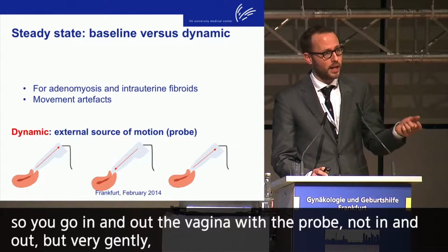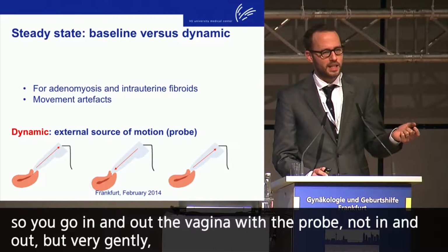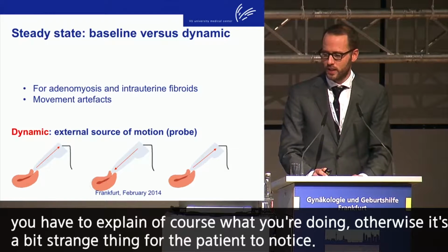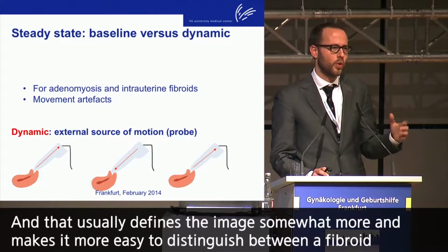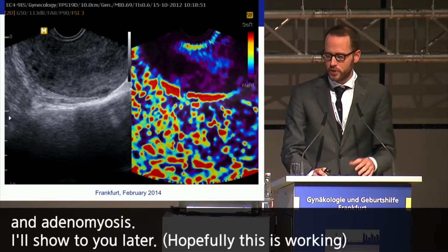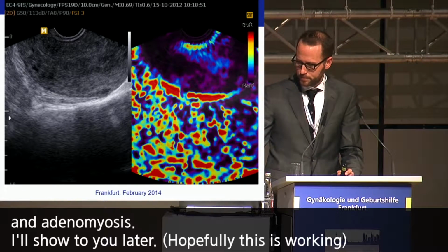So you go in and out the vagina with the probe, not in and out, but very gently. You have to explain, of course, what you're doing, otherwise it's a bit of a strange thing for the patient to notice. And that usually defines the image somewhat more, and it makes it easier to distinguish between a fibroid and adenomyosis. I will show that to you later. Hopefully this is working.